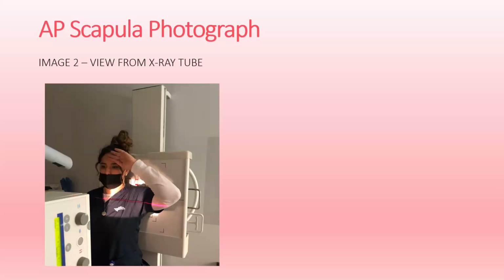Part position: you will make sure that the mid-scapular area is centered to the CR. Abduct the patient's arm 90 degrees, as if the patient is saluting the machine. The patient's hand is supinated.